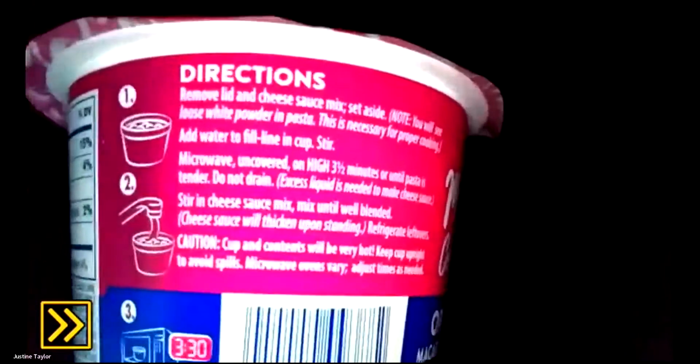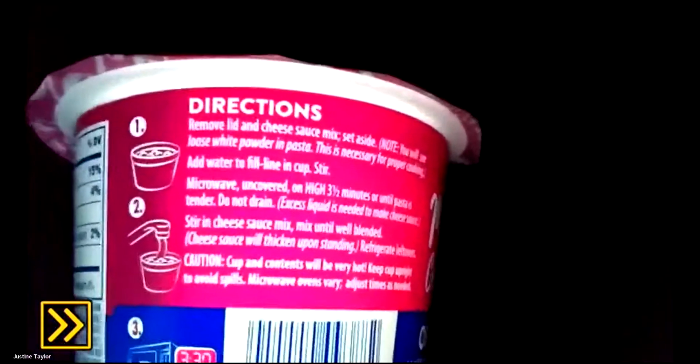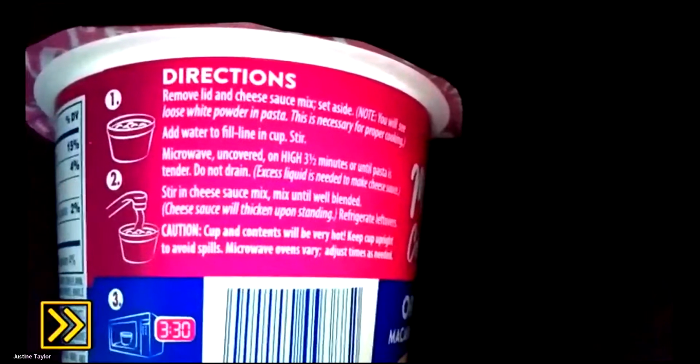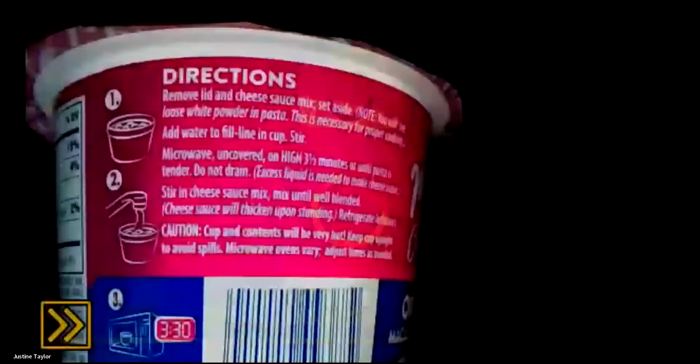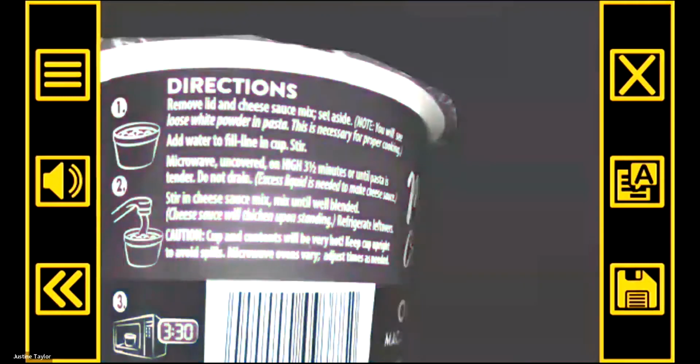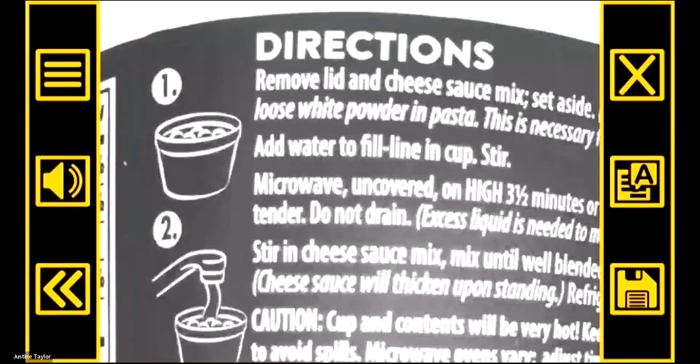So let's say I want to make some mac and cheese and I need to read these instructions. So I want to take a quick capture of the text and then increase capture there. And now I just hear the click. So I know I've taken my picture and I can't really see that color very well. So I'm going to change my color contrast. Grayscale. And now I can read this better.